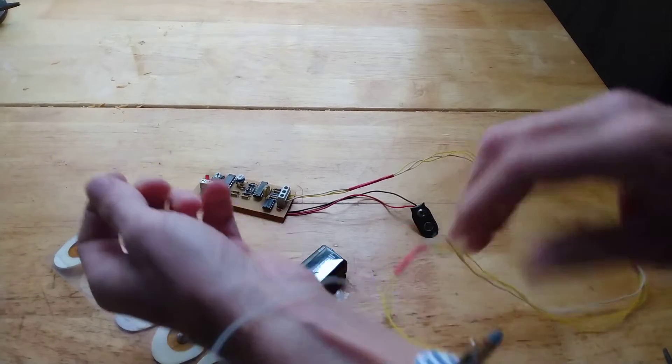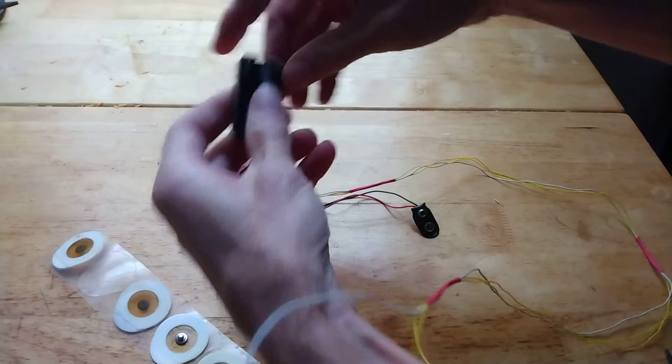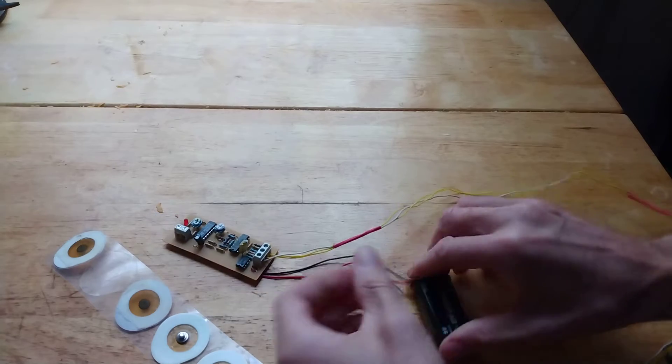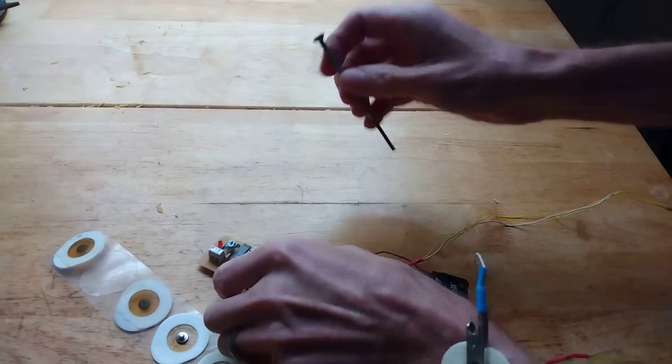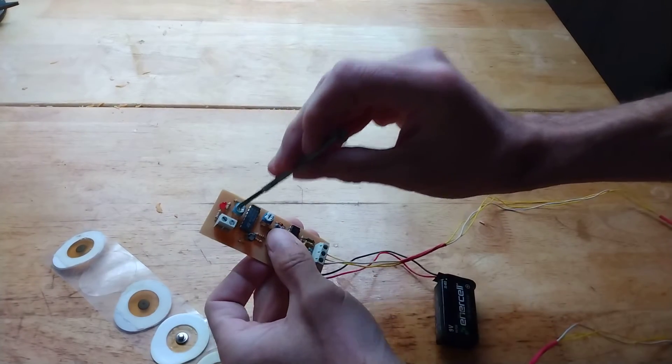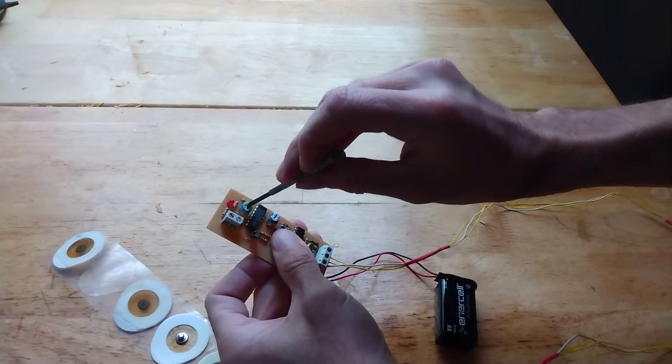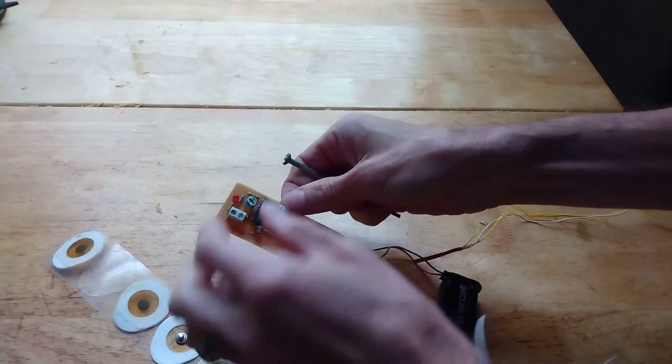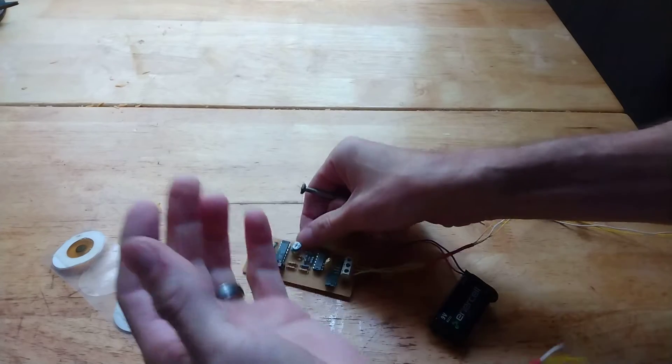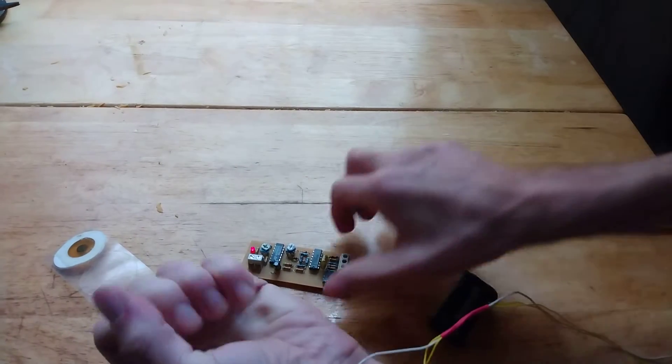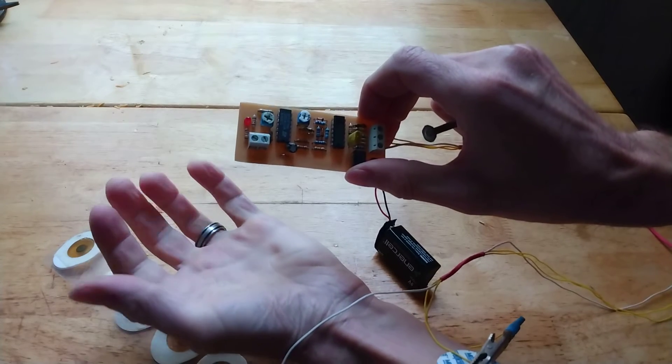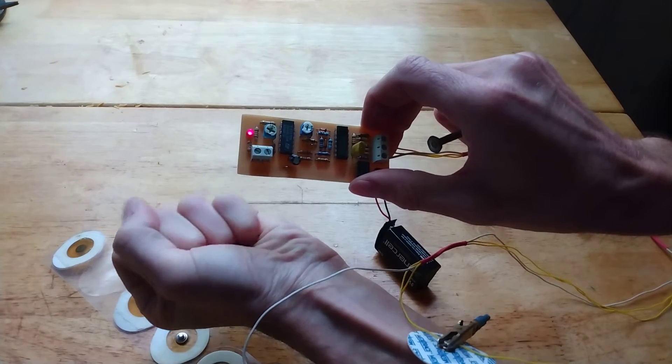Now let's turn on the circuit. So here with this adjustable resistance I can adjust the offset of the output signal. So if I contract my hand, you see now the LED turns on. Okay, so the circuit works.